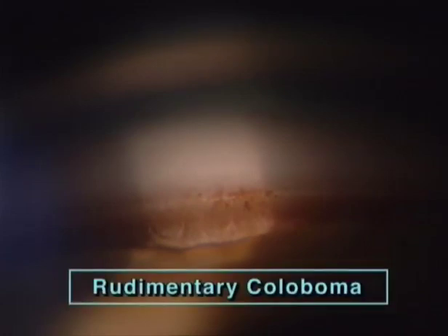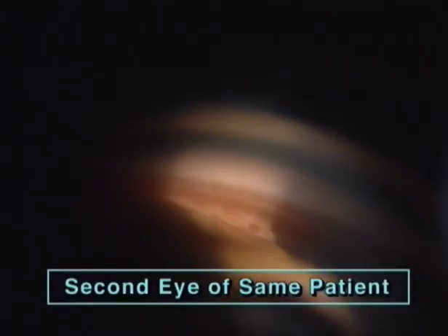Now we scan the circumference laterally, and when we arrive at the bottom, the angle becomes wider and wider. When scanning, bear in mind that the lower nasal angle is a typical location for rudimentary coloboma. This suspicion is confirmed here by examining the second eye of the same patient, where we see the same widening of the lower angle.